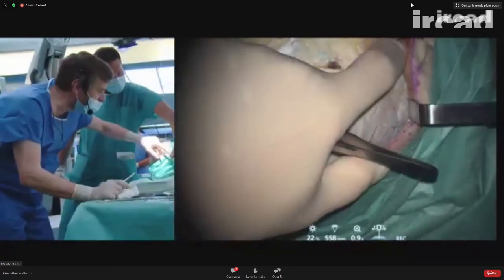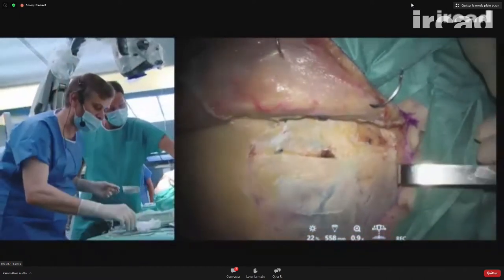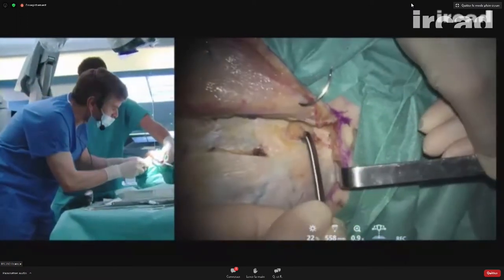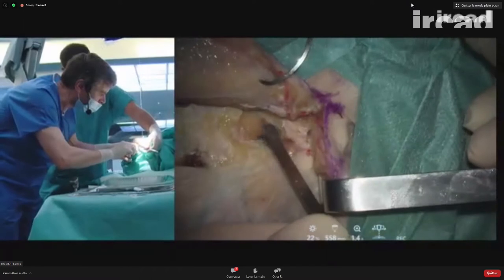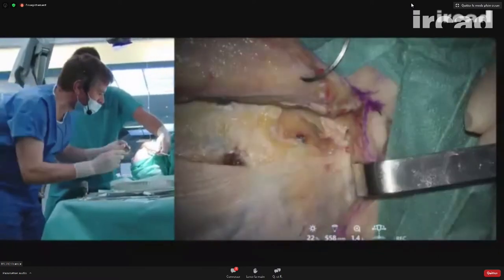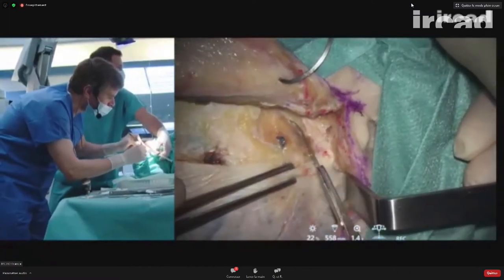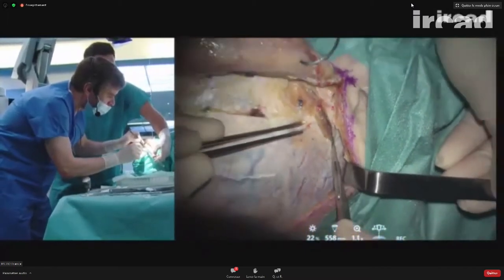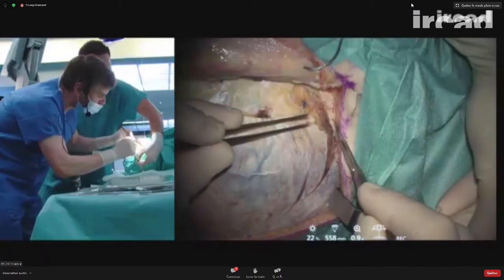So I have all the limits of the muscle. I will make an incision all around. Here is the root of the zygoma. I can here identify the inferior limit of the muscle at the level of the posterior root of the zygomatic arch. And here I'm going to make an incision. You may leave a cuff of muscle, depending on your preferences. You see?